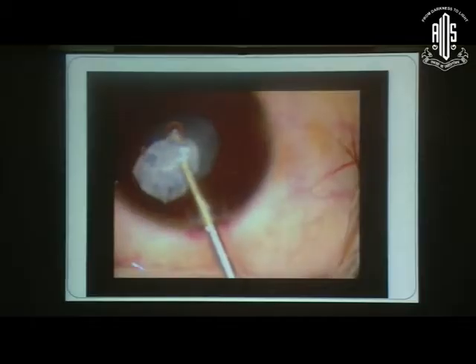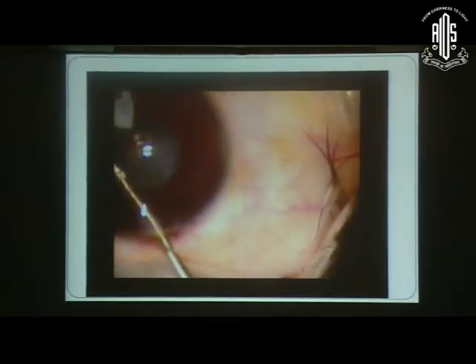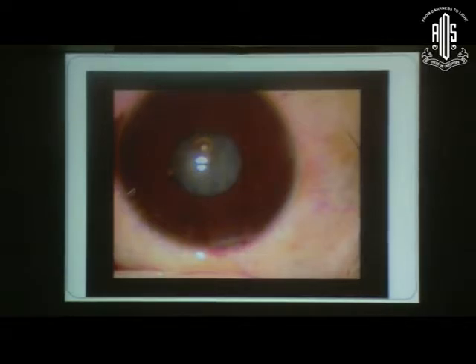So there has actually been a paper where they have described that this plaque can actually be used as a template for maintaining the size and shape of your rhexis.